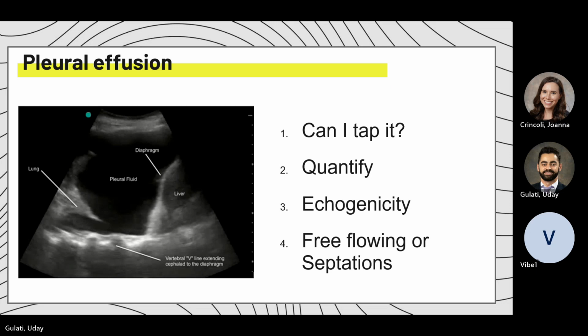And by the way, this is another finding. If there's a lot of fluid, right? Fluid is ultrasound's best friend. You can go through the rib. Here's your pleural surface. Because everything gets seen better with fluid in between, which is why we put gel on our probes, you can see all the way back to the vertebral space. And this is what we call a V line.